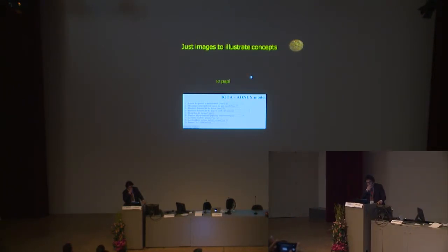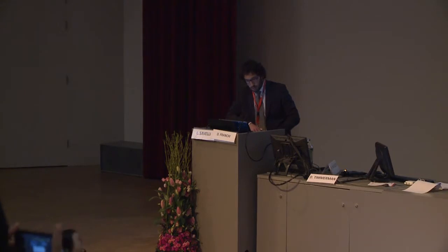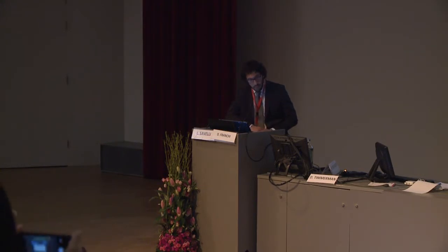It seemed to be a struma. Yes, probably. Who thinks it's a struma? Yeah, I think so also. Because it looks slightly like a dermoid unilocular cyst, but within the cyst there is a solid mass which is perfused. And it's usually really happening in the thyroid tissue, so it can be a struma.